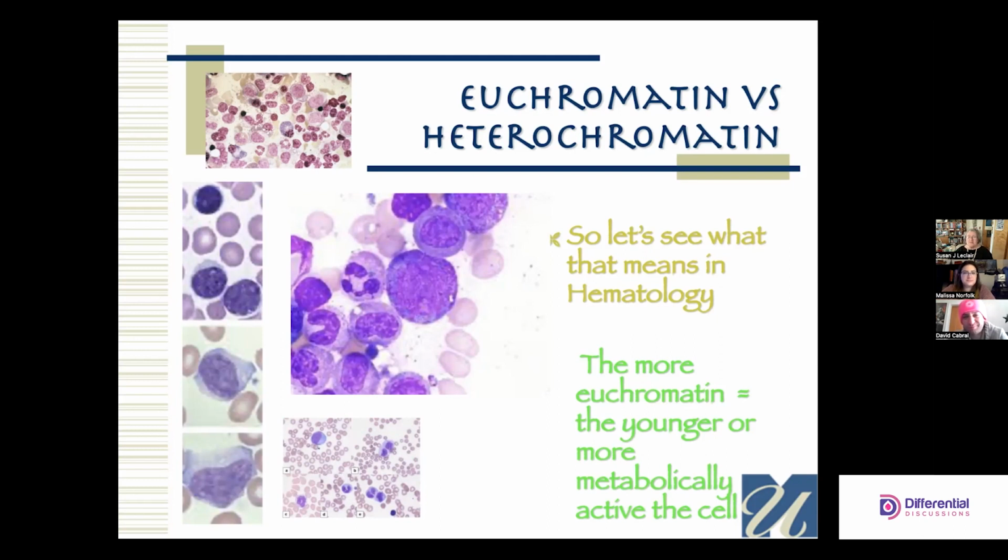Why did you do that? Because we didn't know what it did. We knew that they were increased in some diseases, but we had to wait for Bob Good to invent the immune system to be able to see what was going on. So what do we now know about these cells? They've got a lot of heterochromatin around the sides, and lumpy, really dense heterochromatin here.